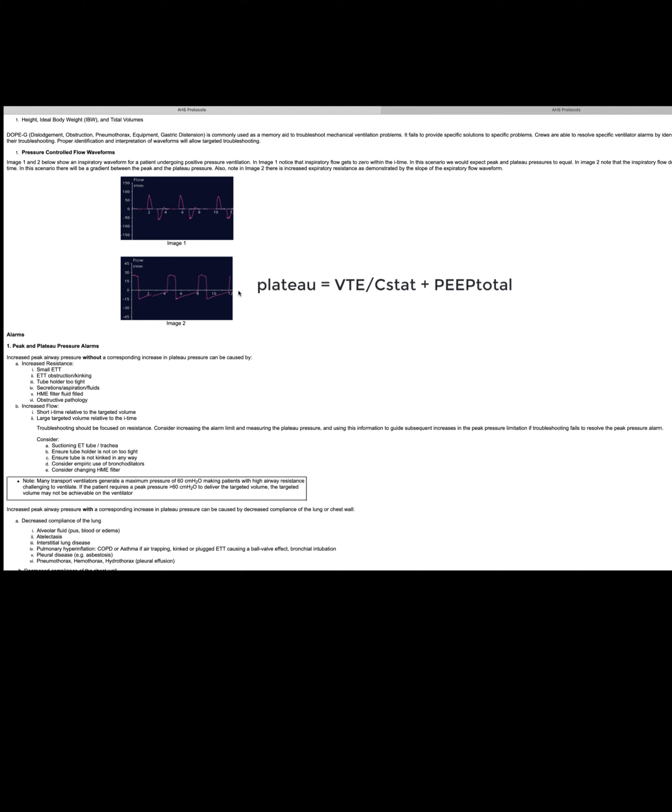So it's the amount of PEEP that you have dialed in plus any auto PEEP is the exact formula. Yeah, and just to emphasize what Chad said, so many ventilators block exhalation. They allow time for that flow to settle out, and then that will give you a plateau. We already discussed what the Hamilton does when we push that inspiratory hold button. It actually maintains flow to maintain your peak pressure, so it does not measure a plateau pressure when you push that inspiratory hold key.